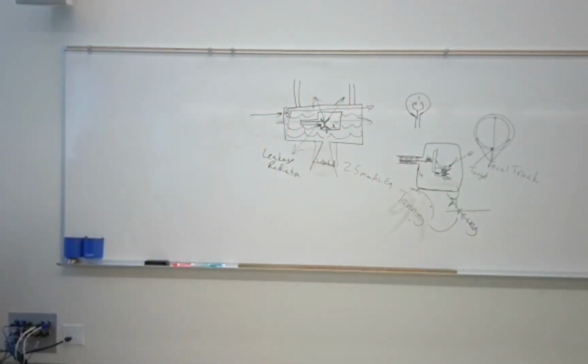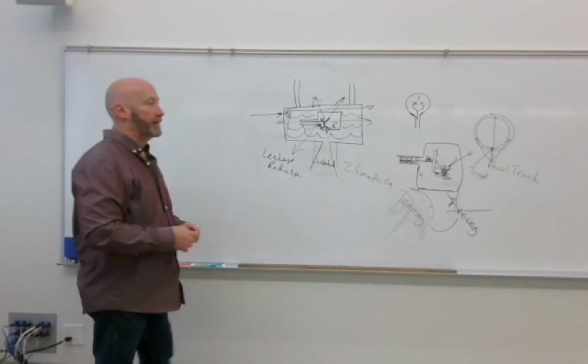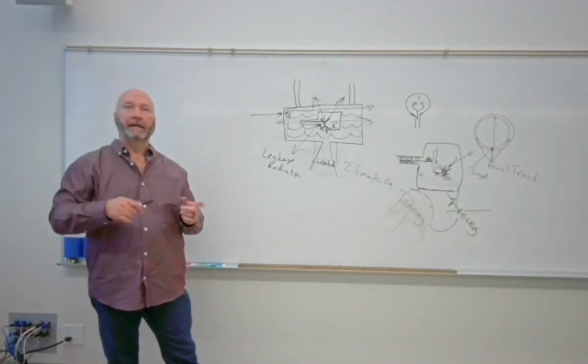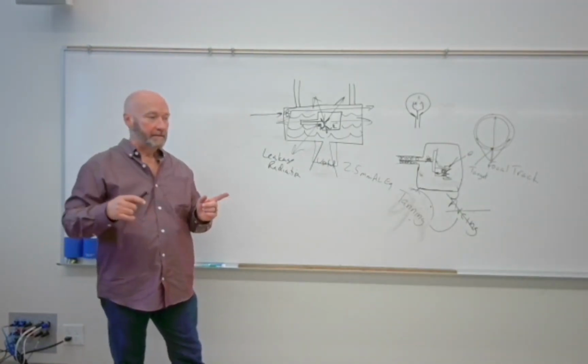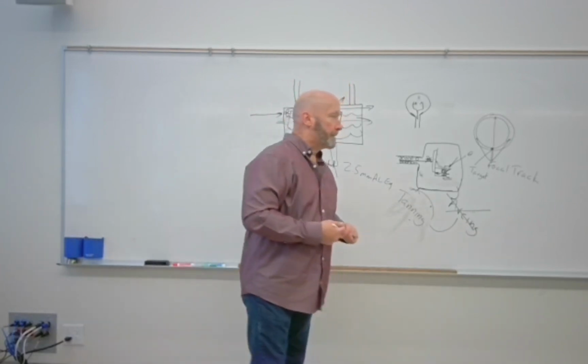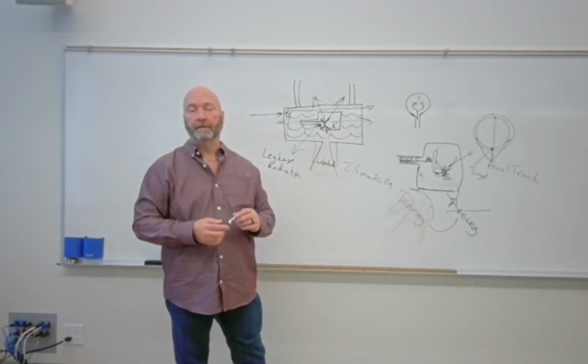Okay? So the anode, again, is made out of tungsten, but if you look on page 119, we've got some different reasons for it. Conductivity, the atomic number. The importance of the atomic number in this case is kind of getting into the next section with X-ray emission. How do we create X-rays? Two different ways.